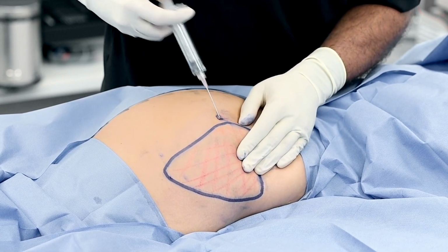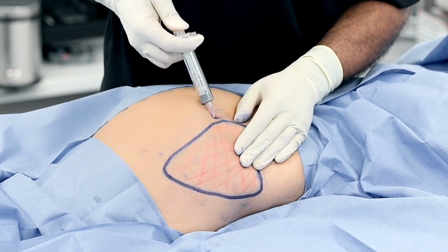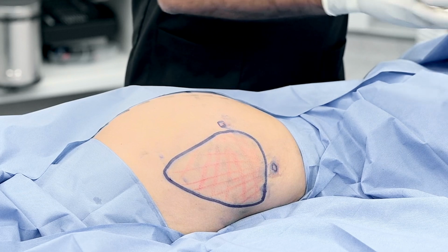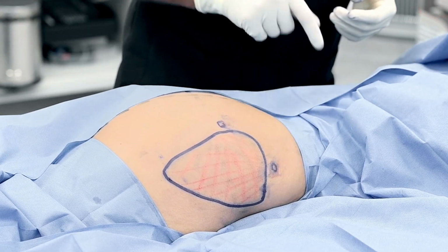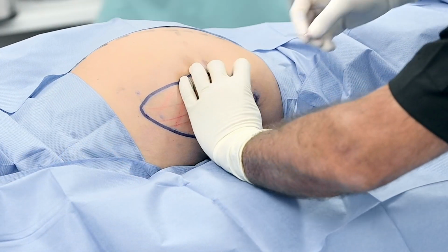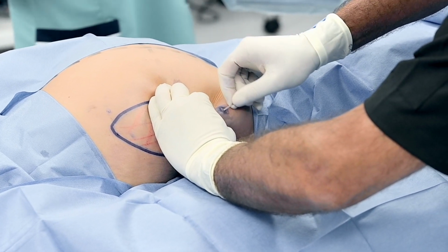We need to go quite anterior. This is what we call the anterior hip expansion, to be able also to correct the hip dips, not only from the back, but also from the front. Now we are going to change the entry point. So now we are going to change the entry hole. I'm going to use this upper approach.